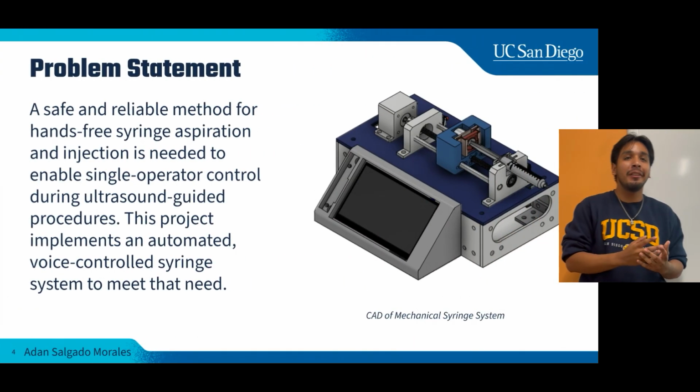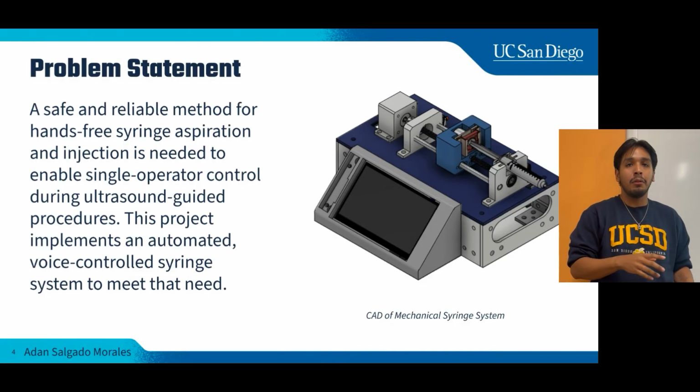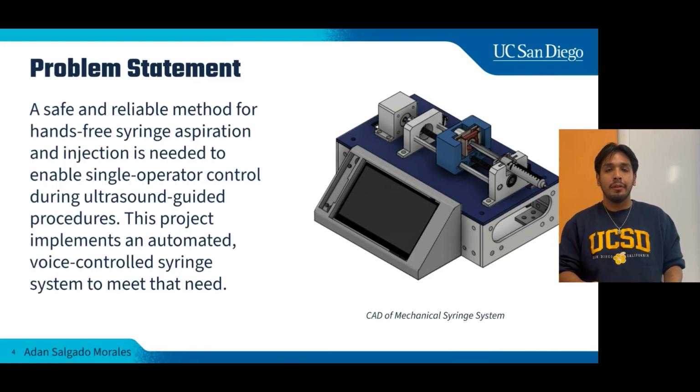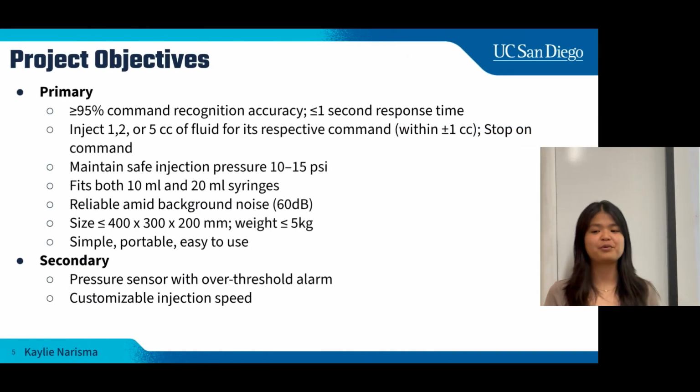So what we needed to do was find a safe and reliable way to allow a single person to be able to complete a local anesthesia procedure. And that's what this project does. We integrate a voice recognition software into an already established syringe pump. Our project was tasked with the following requirements.